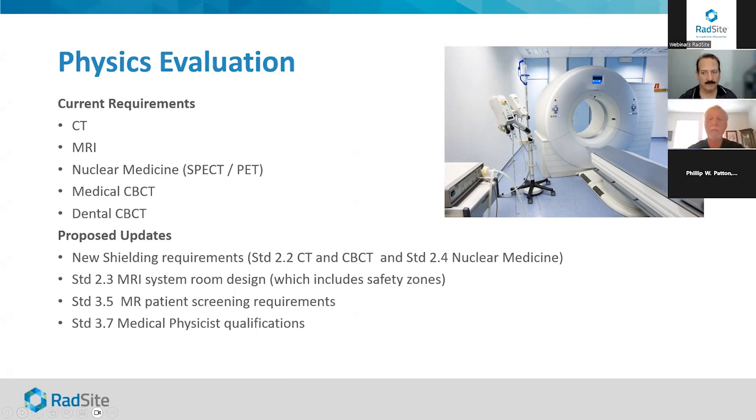The parameters we look for, well-established parameters. For example, for CT, we're looking at what's the high contrast spatial resolution, what's the low contrast detectability, and several other parameters. And these come about from basically experience with working with radiologists and working with service personnel from different vendors, trying to determine how do we accurately determine if that modality or that unit is performing the way it should.